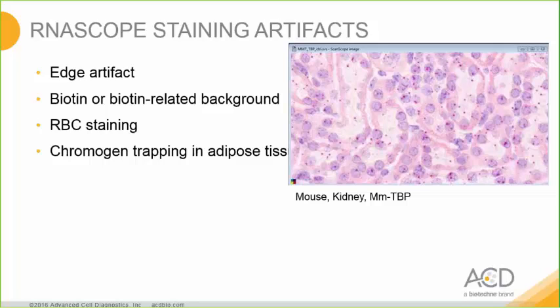An endogenous biotin background, most common in the kidney and liver, results in tissue with a pink haze, almost reminiscent of eosin staining. But you can see that it is distinct from the true signal of punctate dots, here seen in red. While we don't yet have an official protocol to reduce this biotin background, ACD support can certainly help you with your concerns or questions regarding this.